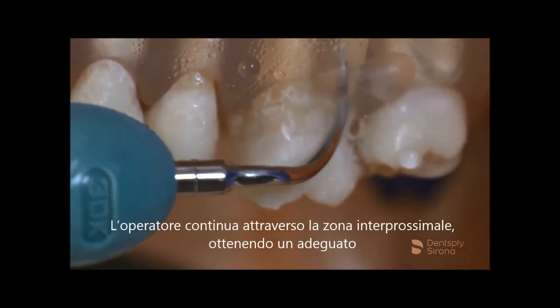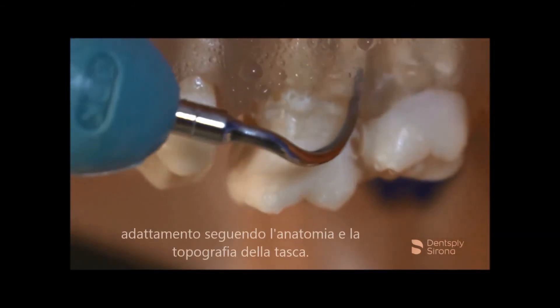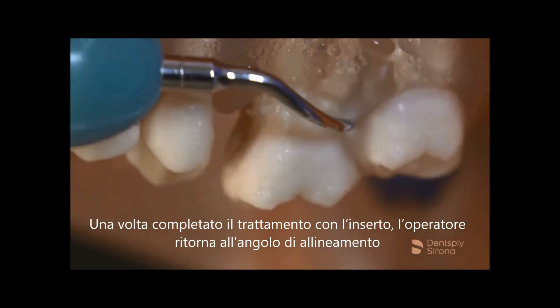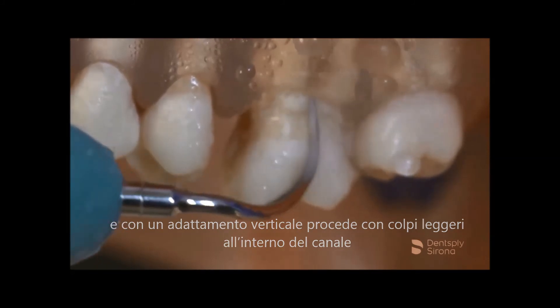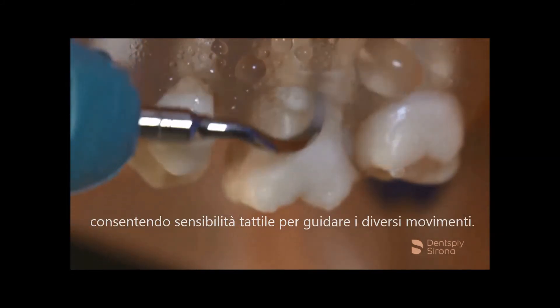As the clinician proceeds towards the interproximal area, proper adaptation is achieved by staying with the anatomy and following the topography of the pocket. Once thorough instrumentation has been achieved, the clinician returns to the line angle and with a vertical adaptation proceeds with channel stroke across the buccal, allowing for tactile sensitivity to drive the stroke engagement.